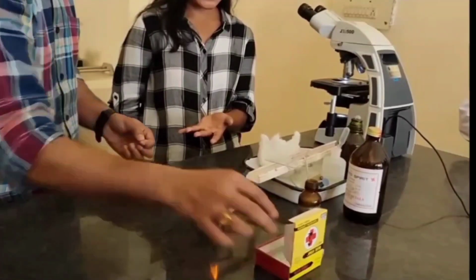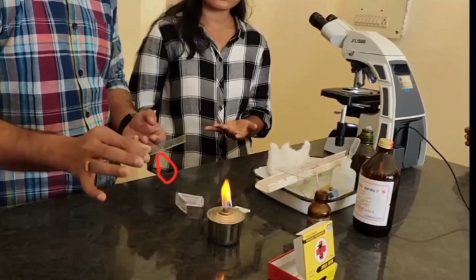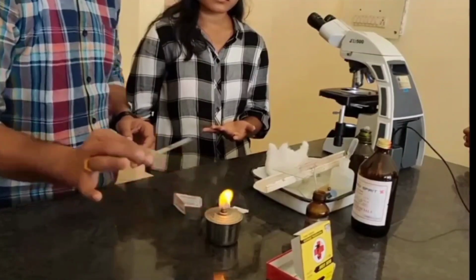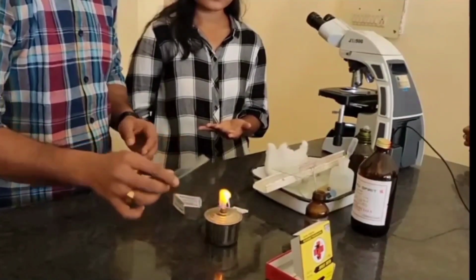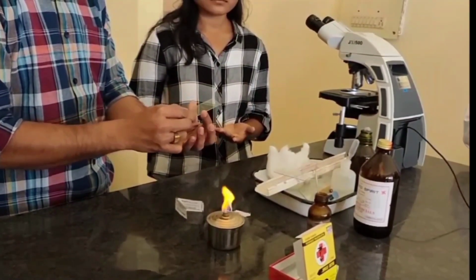Here I am going to show you one more thing, how to put your slide over the flame. You should hold your slide from the side and not from any surface. This is the way we can put a slide over the flame to make it grease free. The grease, or oily thing, will be evaporated by the use of this heat.